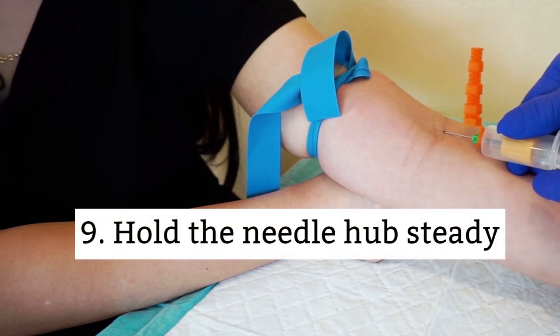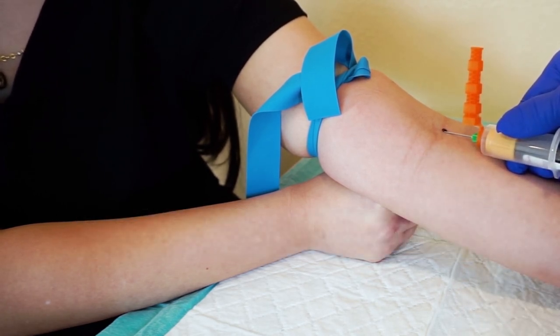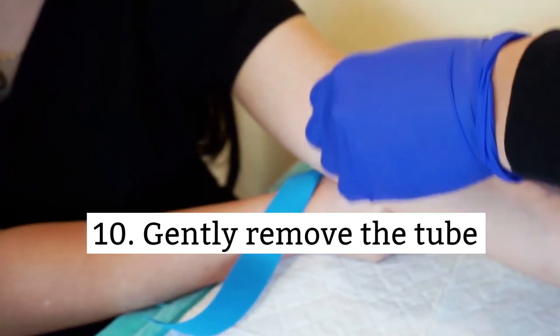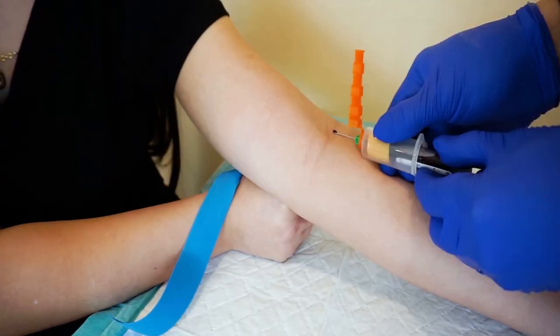Ninth, hold the needle hub with your index and middle finger and push the tube in with your thumb. Holding it this way will help absorb the energy to prevent the needle from going in too deep. Tenth, wait for the blood to fill up the tube, then gently remove the tube, holding the hub steady with two fingers while using the other three fingers to remove the tube. This is to prevent the needle from pulling out as you are removing the tube.